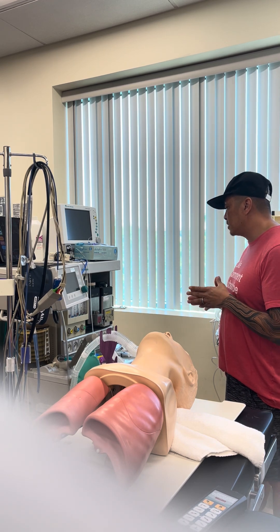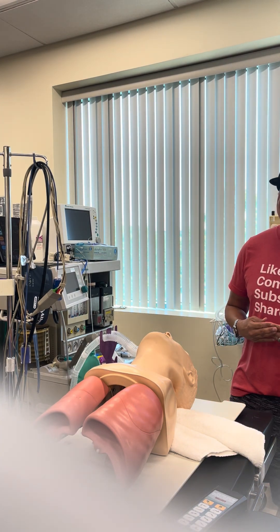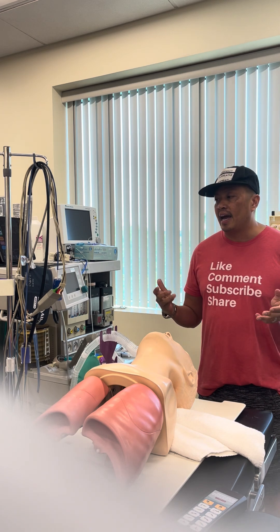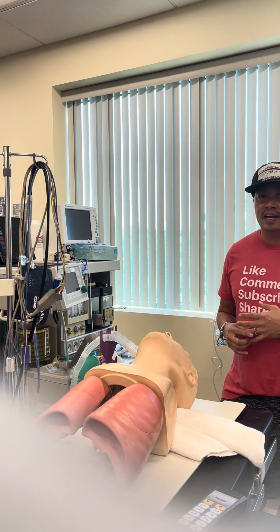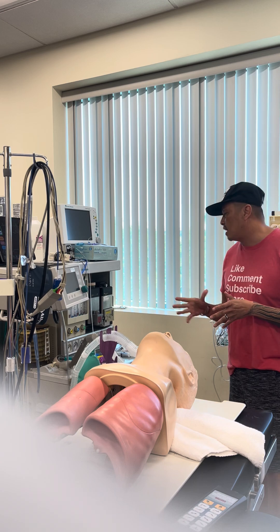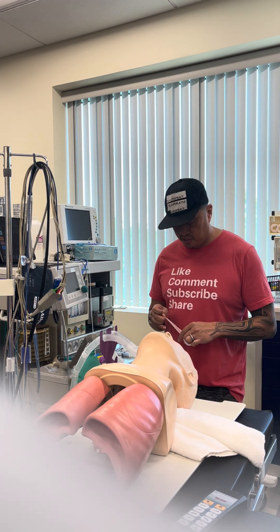So next I'm going to go into my IVs. I went to the pre-op and evaluated the patient. I know that he has a working left AC IV, and I also have two IV poles on each side of my bed. I have appropriate fluids running, and I have IV machine pumps programmed and ready to go if I need them. I also have tape — two different pieces of tape. One is for the patient's eyes; I'll put them on the mask so I don't forget.